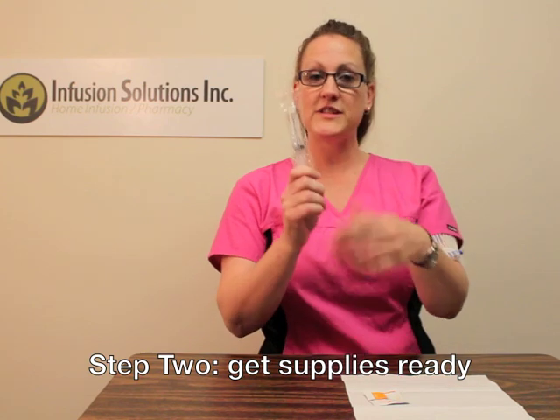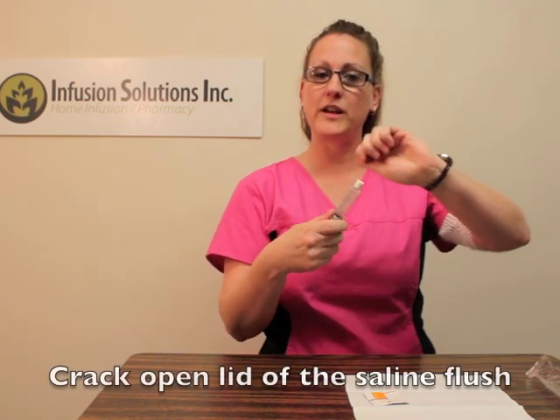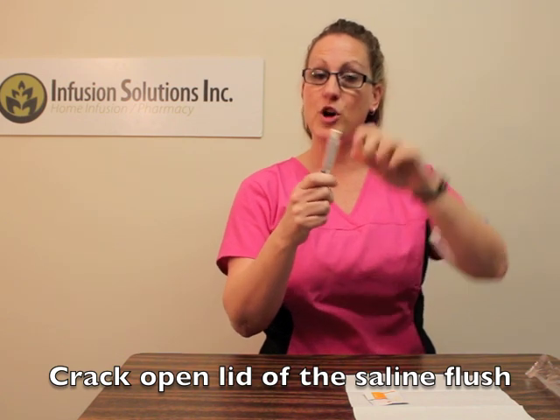Now that you've cleaned your hands and gathered your supplies, let's get them ready. Take your normal saline out of the package, and give the lid a little snap to open it, so it makes it easier when you're ready to use it.